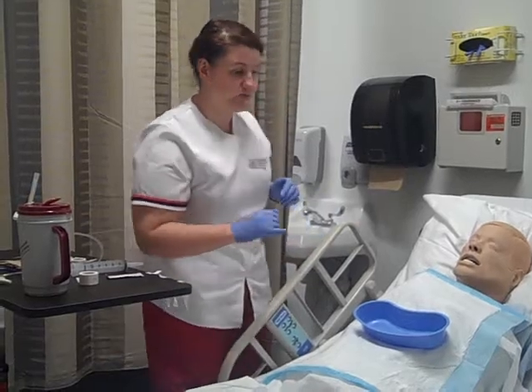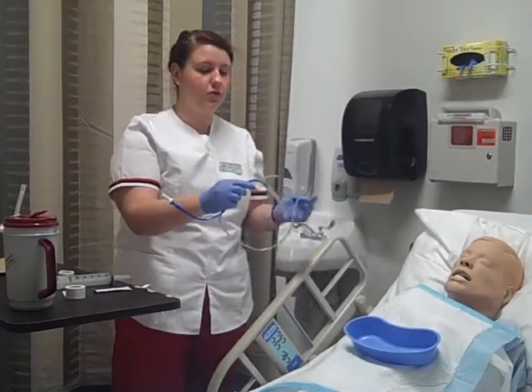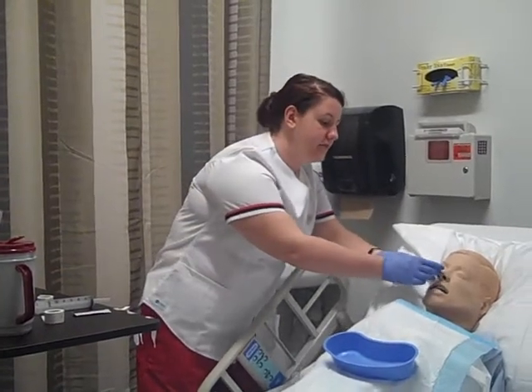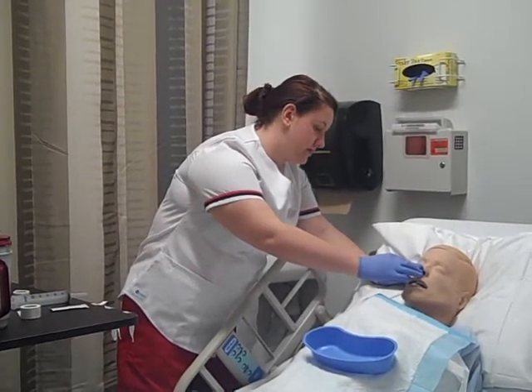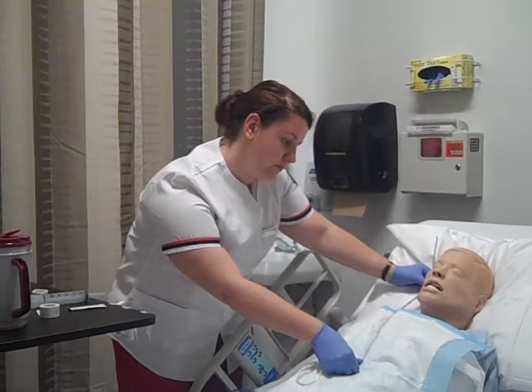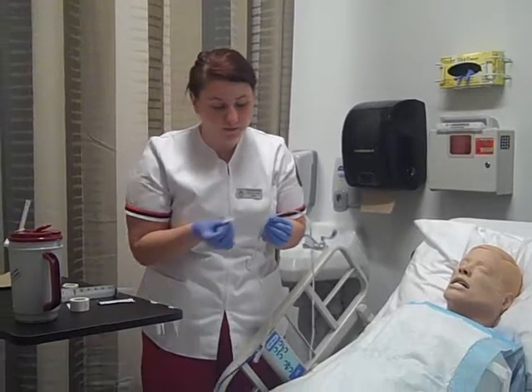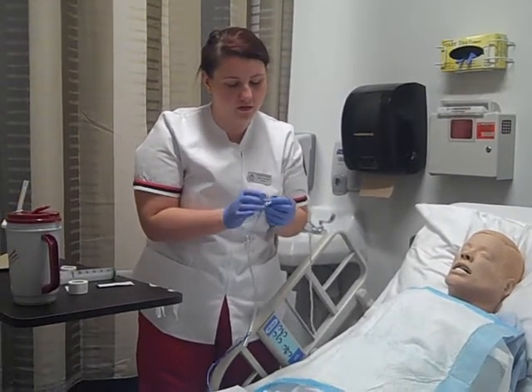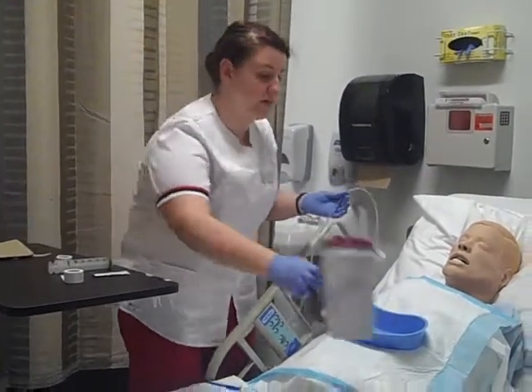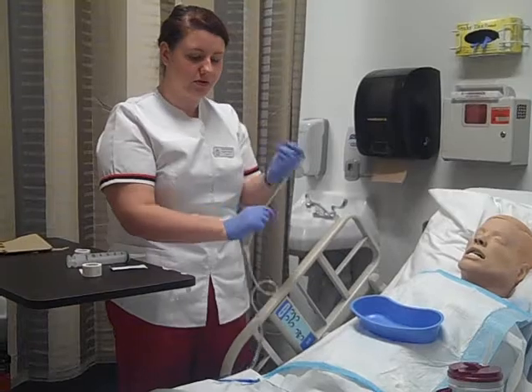And here is your NG tube. I'm going to measure it first — from the tip of your nose to the top of your ear, all the way down to the xiphoid process. Okay, and we are at 60 centimeters, so I'm going to mark that. And I'm going to place your basin. Here's your water cup, because when I begin, I'll tell you when you can use it to help you swallow. I'm going to coil the tube.